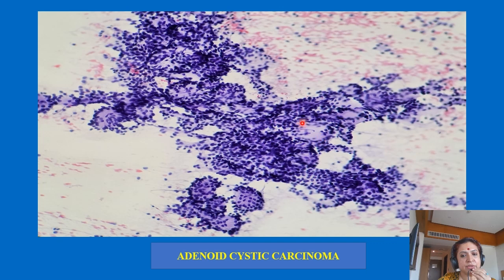Here, as you can see, these are rounded, definite. There's no fibrillary quality to it, and the cells also are not merging with the hyaline matrix. They maintain their own space and are actually separate from the matrix, unlike pleomorphic adenoma, where you see the cells embedded within the matrix.